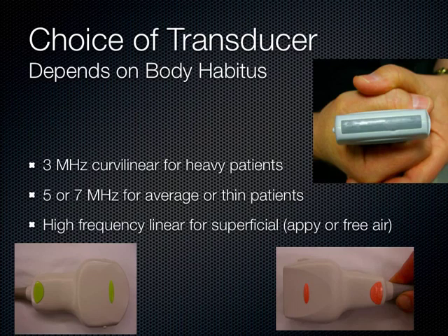So when you look at the bowel intestines with ultrasound, you would like to use, like everywhere else in the body, the highest possible frequency so you get the best possible resolution, as long as you can penetrate to the depth of interest. And so usually on most patients with the bowel, like for the appendicitis and stuff, we use this linear probe. That gets us our answer almost all the time, which is great because it's high frequency. Though occasionally we have to use the lower frequency, in this case the curvilinear probe, down in that 3 megahertz range. In a larger patient, we have to turn to this transducer sometimes, but almost always I can get by if I push hard enough with the linear transducer. We get really nice images.